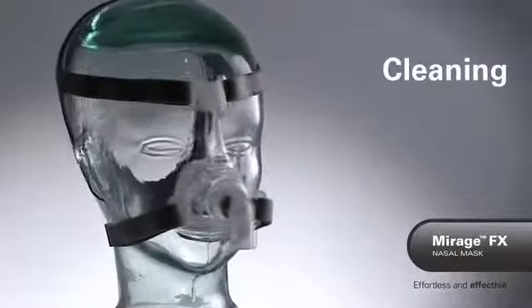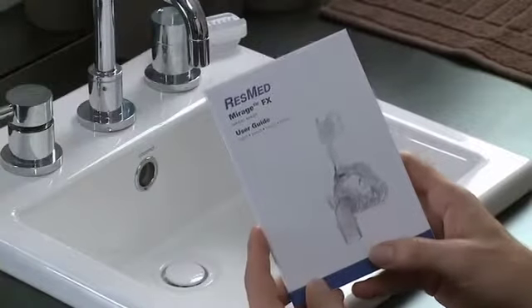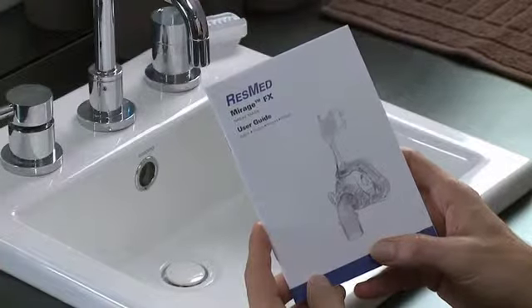You should clean your mask on a regular basis. Refer to your MirageFX user guide or online for details on cleaning steps and cycles.